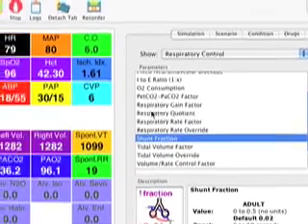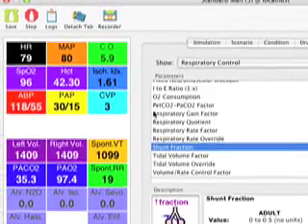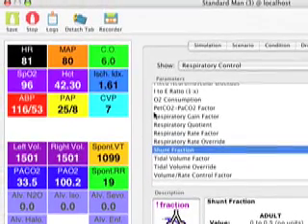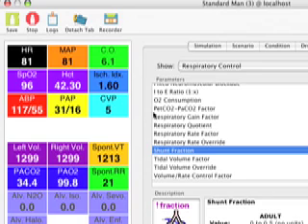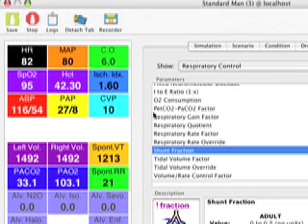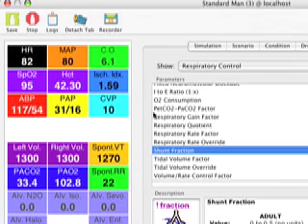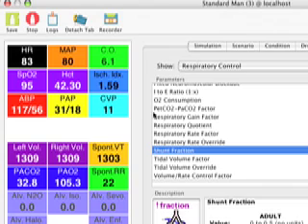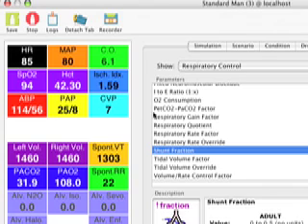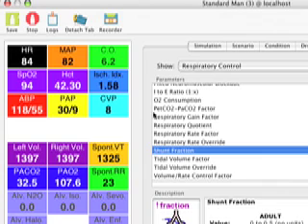So let's see what effect we're having on poor Stan. As you can see, his ventilatory rate has gone up to compensate. His respiration rate has gone up, and his SpO2 is dropping already. It's now at 95%. So what will happen at this point is his O2 sat will continue to drop until one of a couple of things happens.